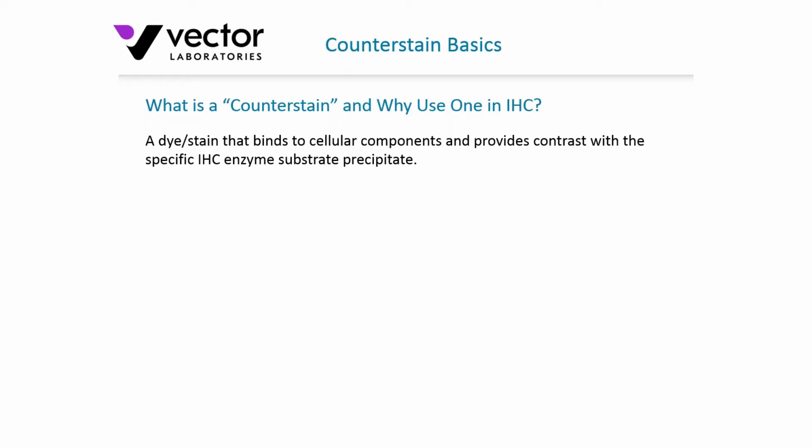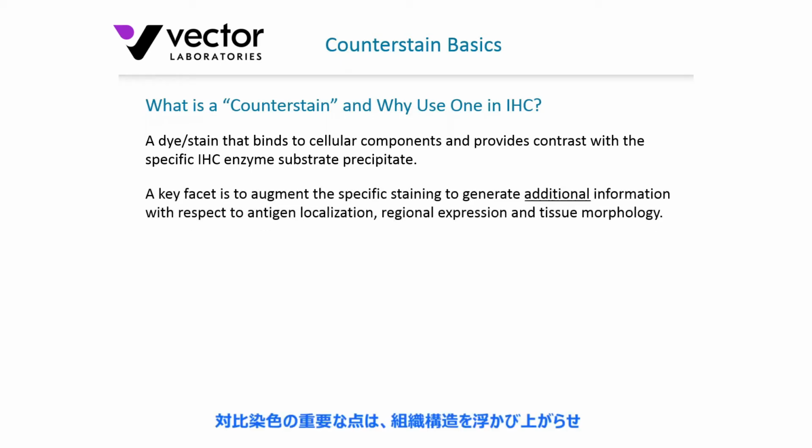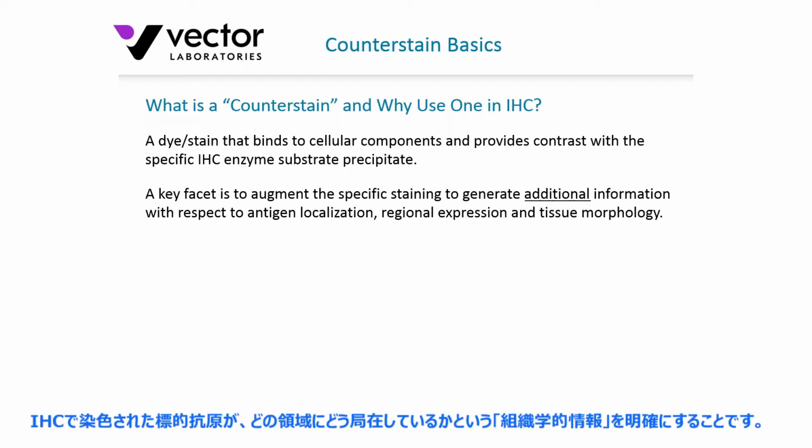And indeed, I will say that one key facet of the counterstain is to augment the specific staining to generate additional information with respect to antigen localization, regional or spatial expression of that antigen, and the tissue morphology.